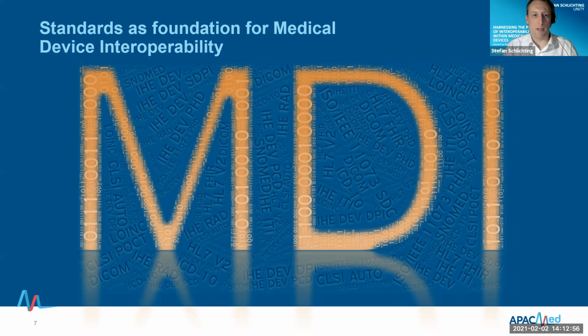Inside of the position paper, we present different standards that range from pure technical specifications, like, for example, the IEEE 11073 standard series or DICOM, over to HL7 version 2 or FHIR and IHE profiles, but we also include standards that are related more to terminology or semantics, like SNOMED or LOINC. And we think that we give a very broad overview of those standards that are applicable in the APAC region for implementing these kinds of scenarios that we have outlined.